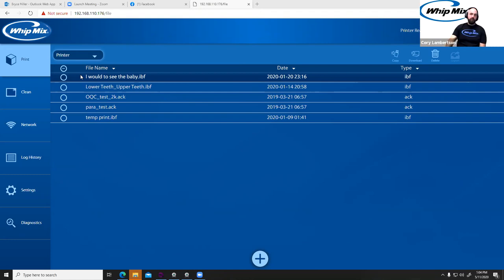Yeah. If you wouldn't spend $2,000, or I think this is about $2,000, maybe $3,000, for this computer for just the Alpha 3D software, you'd use it for CAD software like 3Shape, especially if you wanted to improve the time for software calculations. Yep. Which is why we got it.